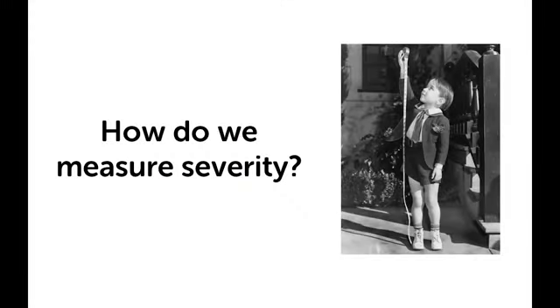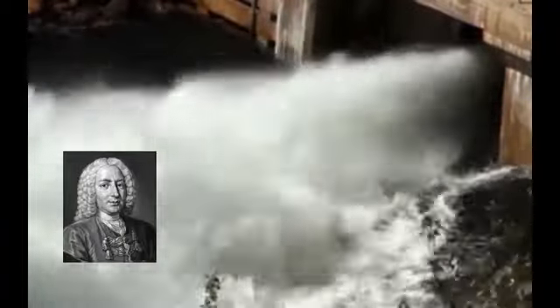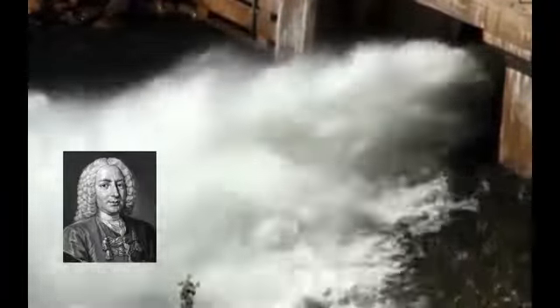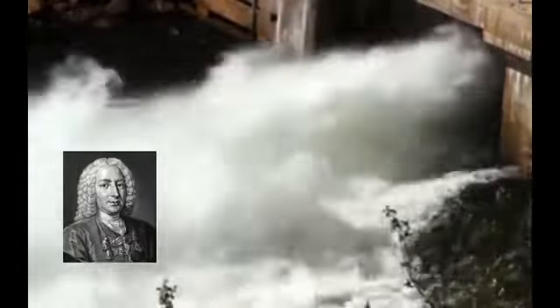Constantly throughout the presentation, I'm talking about quantification of aortic stenosis, but I haven't shown you how to do it. Now is the time. Do you remember this video clip from the first part of the Echo Survival course? I told you I will explain what this video has to do with valvular heart disease, hemodynamics, and specifically with this man here on the left. Well, the reason the water is shooting out like crazy from this tubing is because the tubing represents a narrowing. And if water comes to a narrowing, it increases its speed.